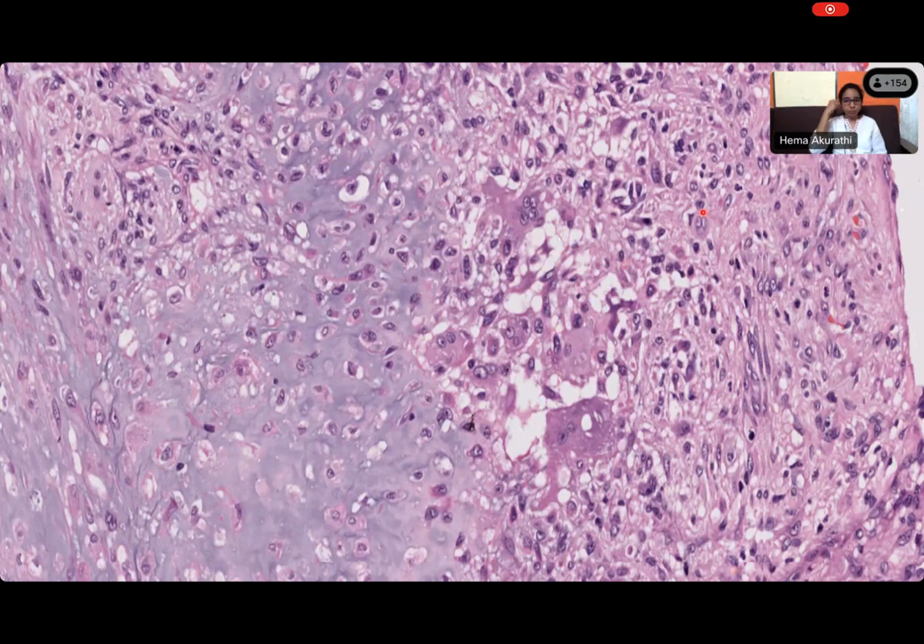So you still see those stromal cells here. You can see them to the right, and you see cartilage. And that cartilage has got what? Is it hyaline cartilage? Is it a bit of the like we saw in the first case? Do you think it's a portion of the articular cartilage that has come out over here? Yes, Prayas? You think? No. The answer is no. It is not the articular cartilage.